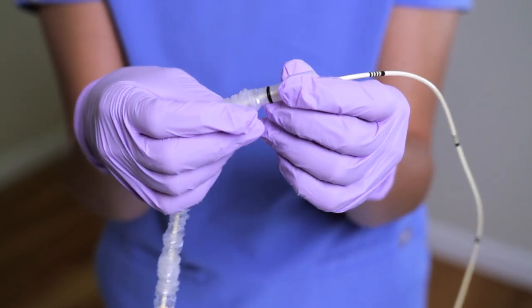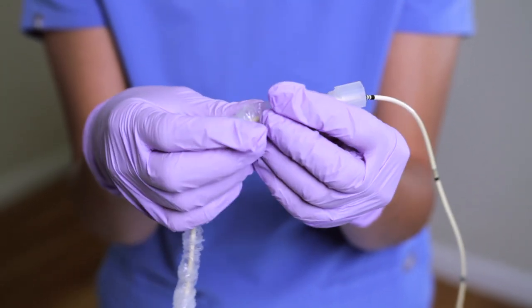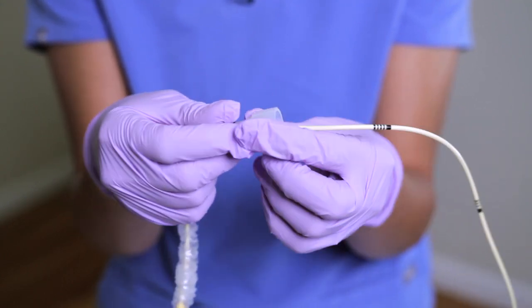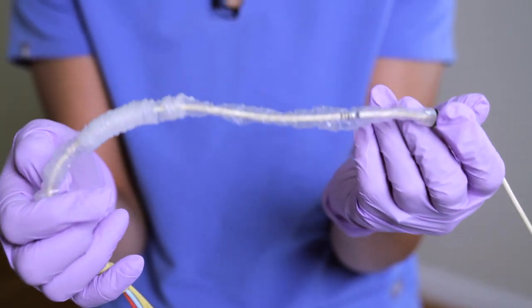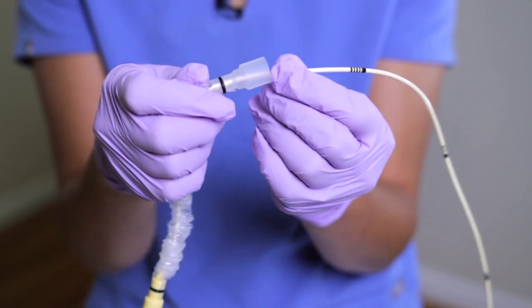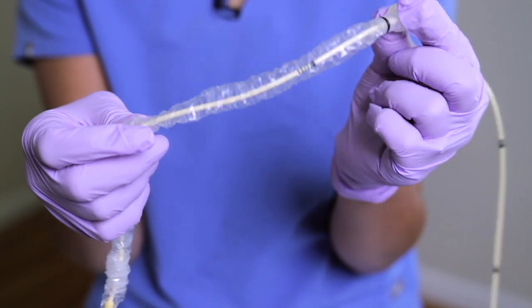This brings me to the contamination shield, which is very important. When the line is placed, it helps keep this portion sterile. You want to make sure it's fully closed and locked in so it's not open to air, as that is a risk of infection. Keep it closed, sterile, and connected to the introducer port.